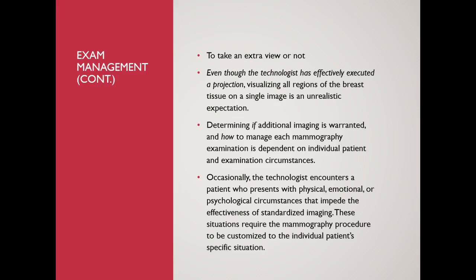Occasionally, the technologist encounters a patient who presents with physical, emotional, or psychological circumstances that are going to impede the effectiveness of your screening mammogram. And these situations require the mammography exam to be customized to that individual patient's situation. As an example, you may have special circumstances that you have to customize for if the patient is confined to a wheelchair.